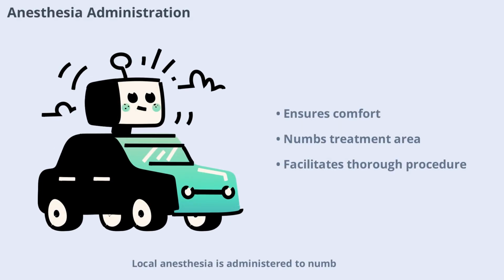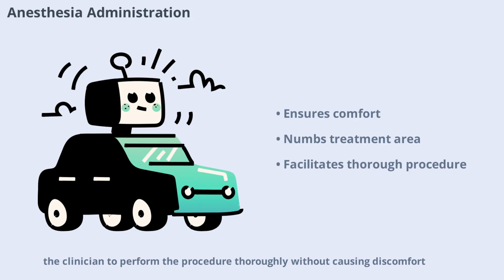Local anesthesia is administered to numb the treatment area and ensure patient comfort. This step is essential for pain management and allows the clinician to perform the procedure thoroughly without causing discomfort.